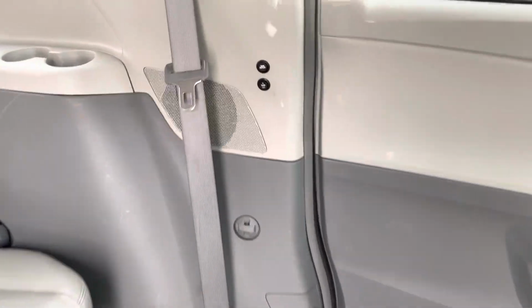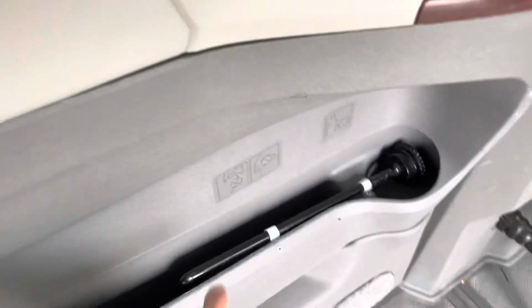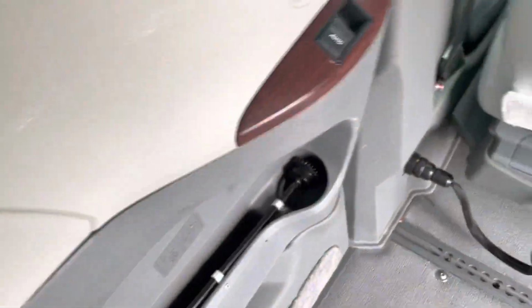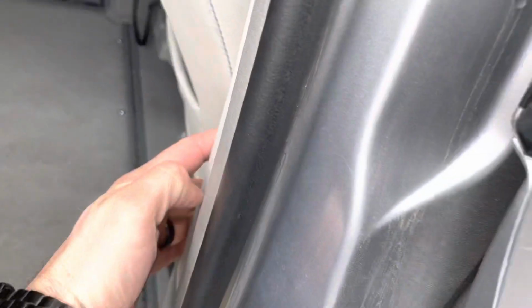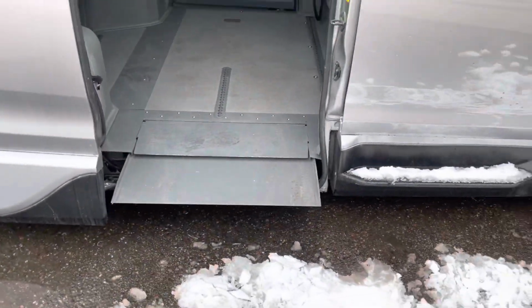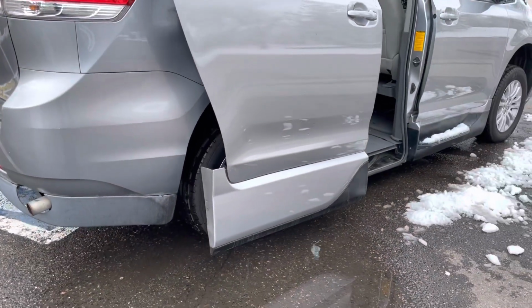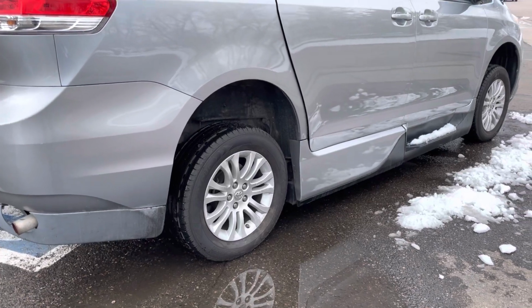You have the sure deploy system here, so you can turn that on and have the ramp come in and out. And then there's a third way. You basically pop this off and you're able to crank the ramp in and out since it's an in-floor ramp. And then to shut the vehicle, there's a button here on the door pillar. So you can click that, or you can click the remote or the VMI button once you're inside as well. That ramp's going to come in, the door's going to shut, and then it's going to raise back up. Just like that.